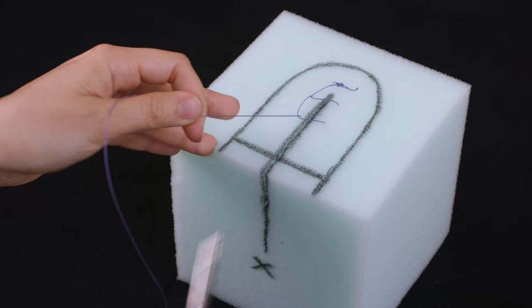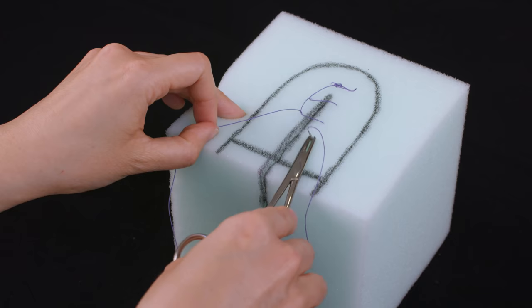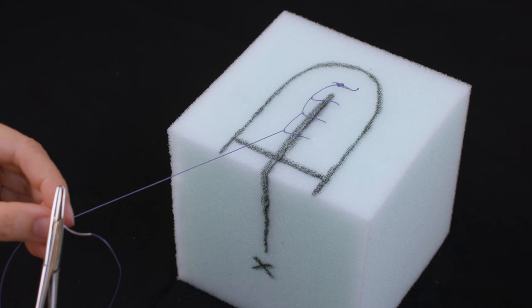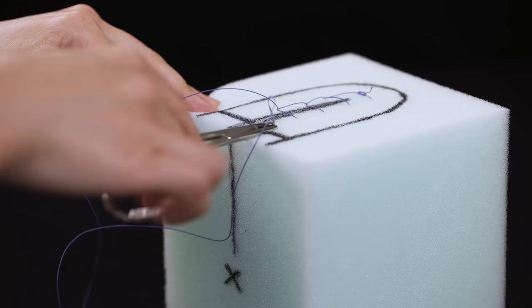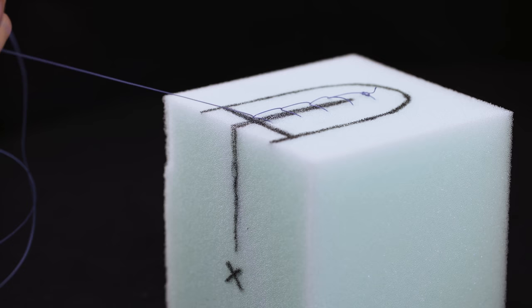Be mindful to incorporate enough tissue into your suture bites so that you don't tear the tissue, but also remember the rectum lies posteriorly. As I approach the hymen, I take smaller bites because I don't want to narrow the introitus, which is uncomfortable for the woman.